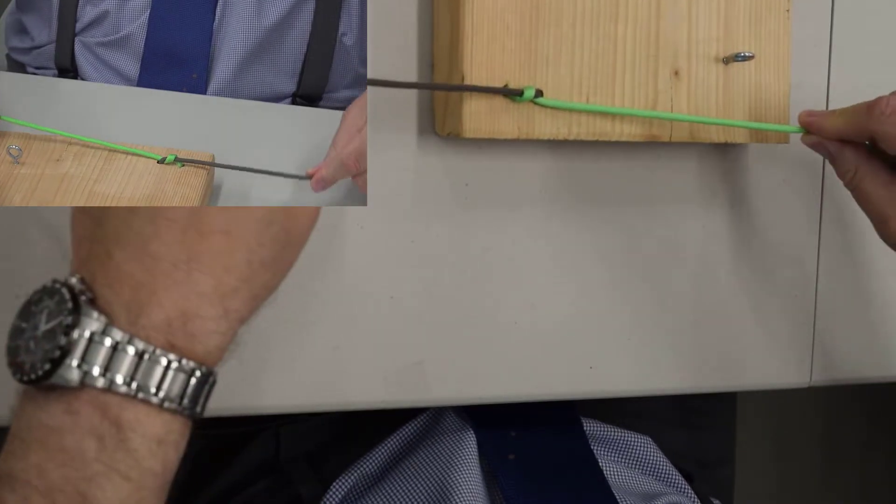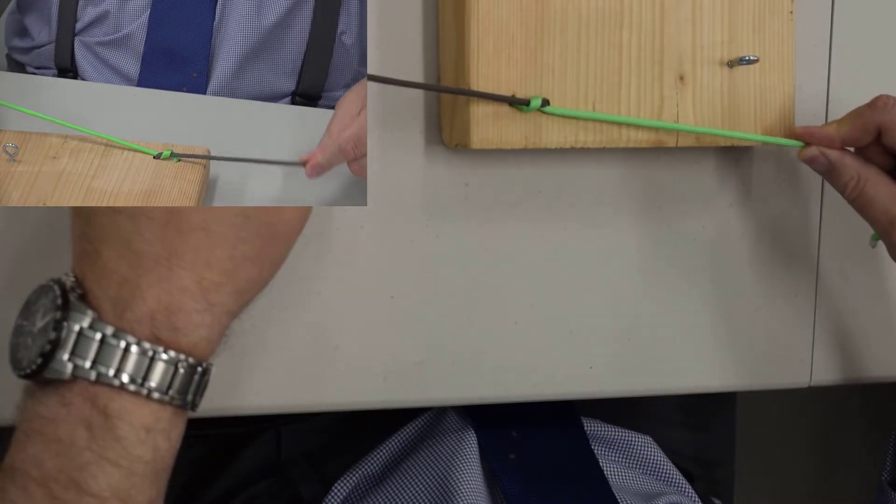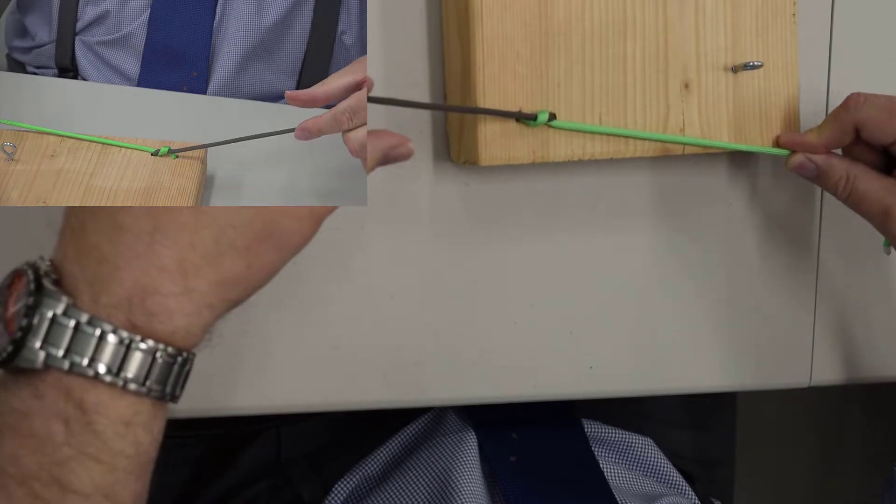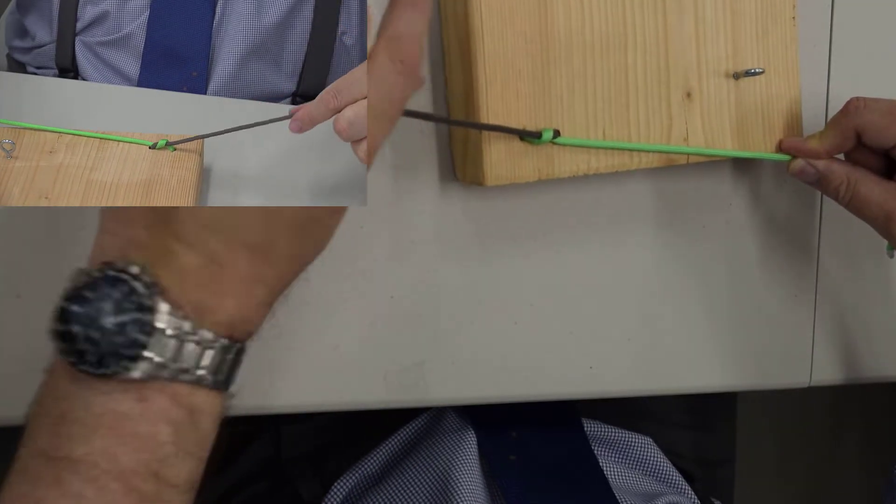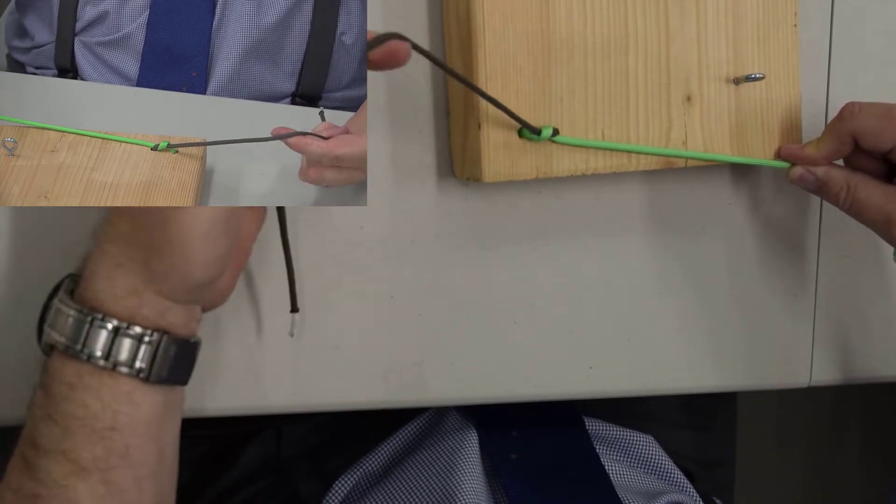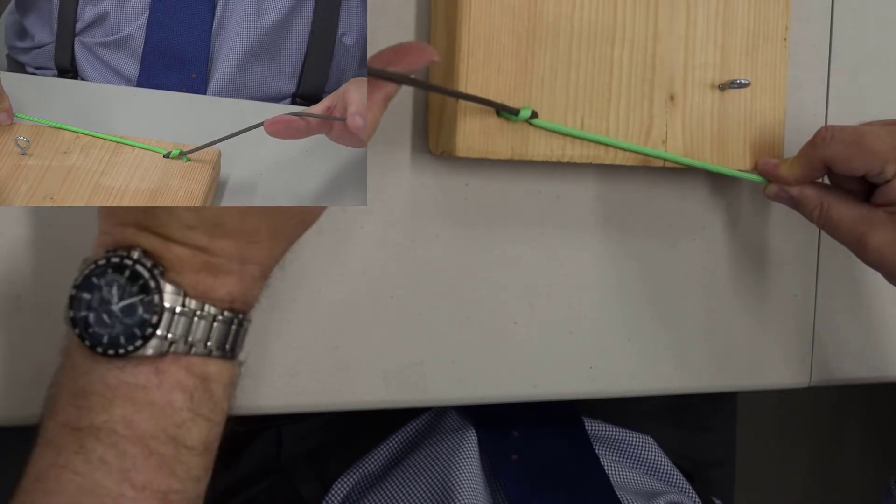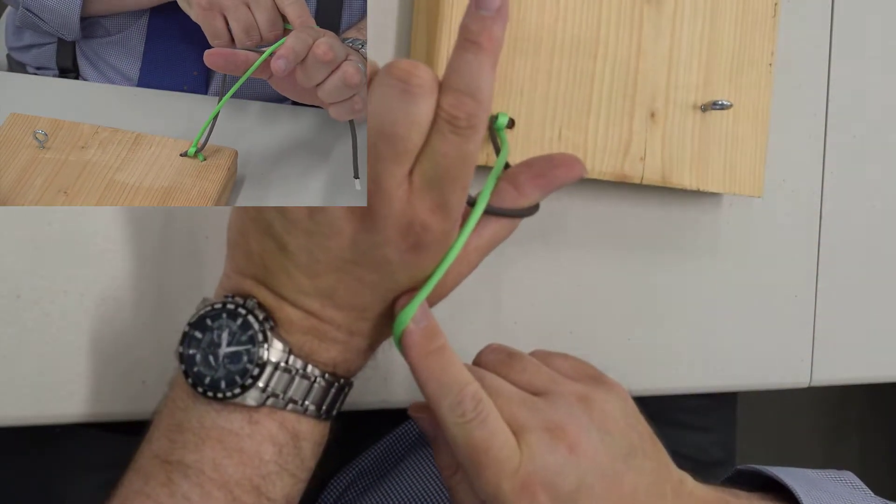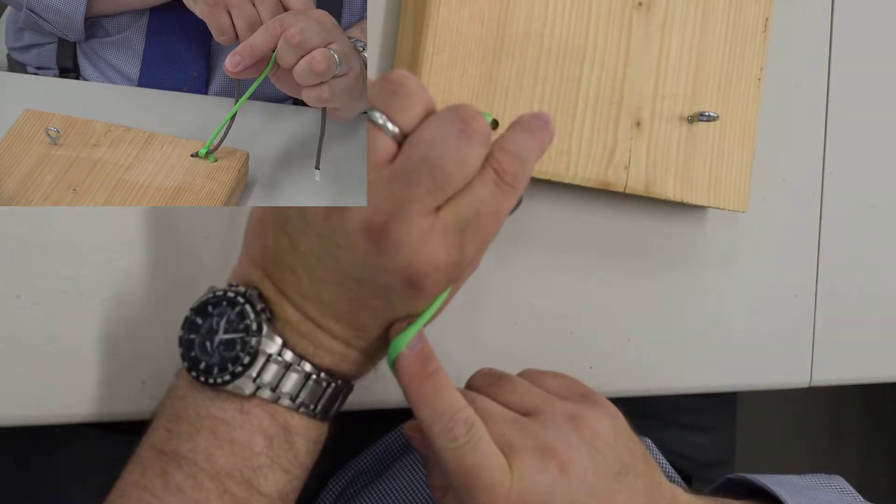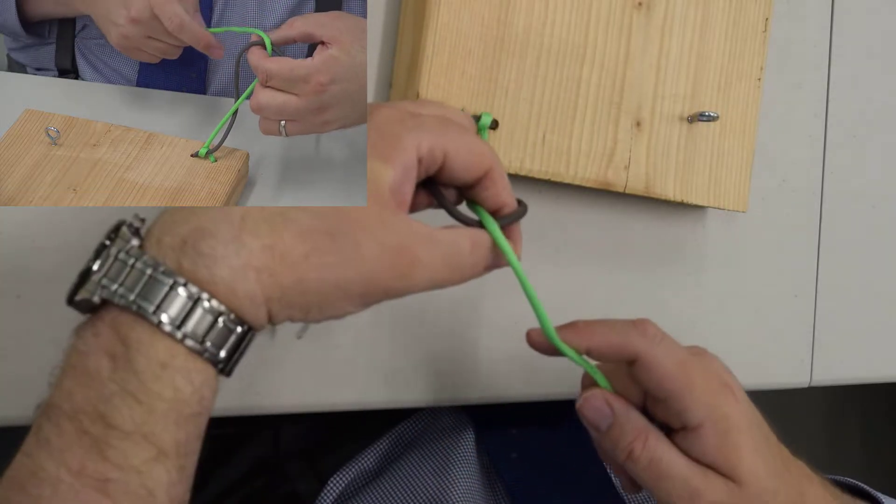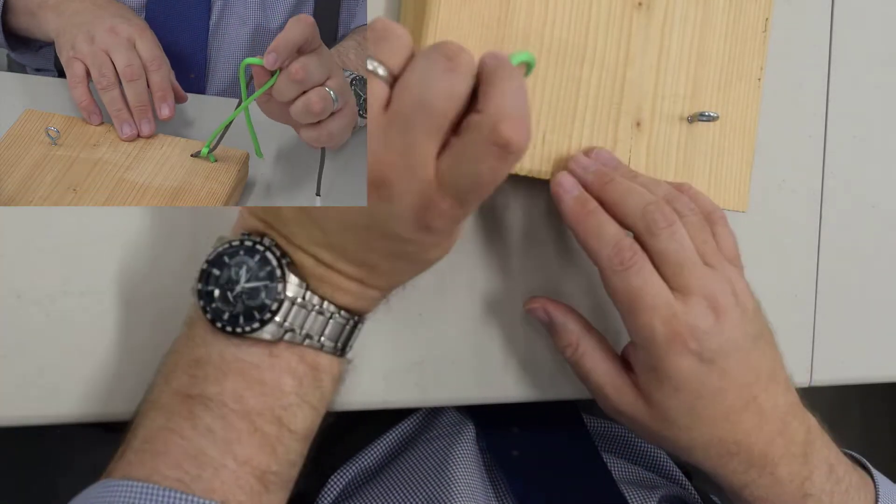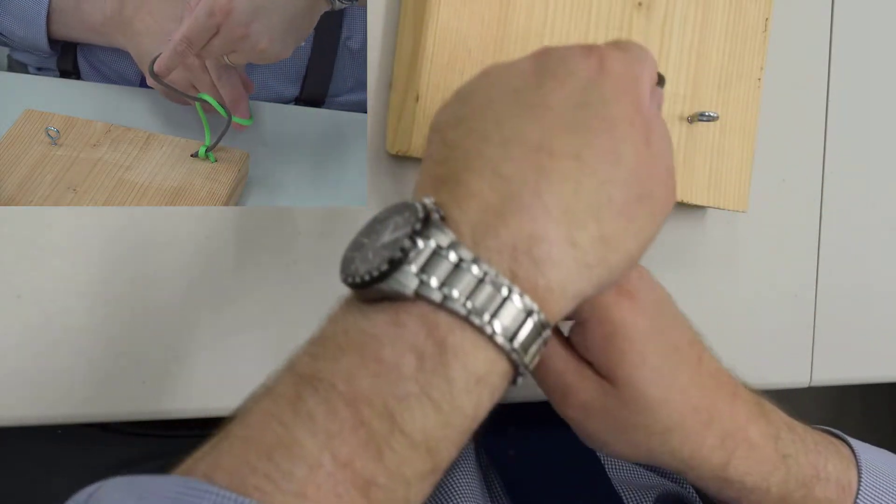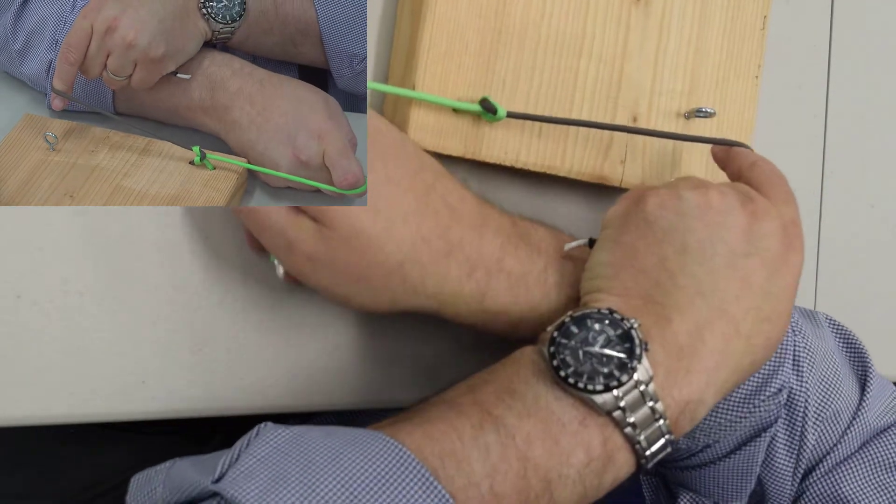The other half now, if you notice, I'm set up now to simply use my thumb. I could do gun, but I started with that one. So I want to do gun and then thumb. So crossover, pinch, rotate again down, hand it to myself, tie the knot, and you notice I'm crossing my hands.